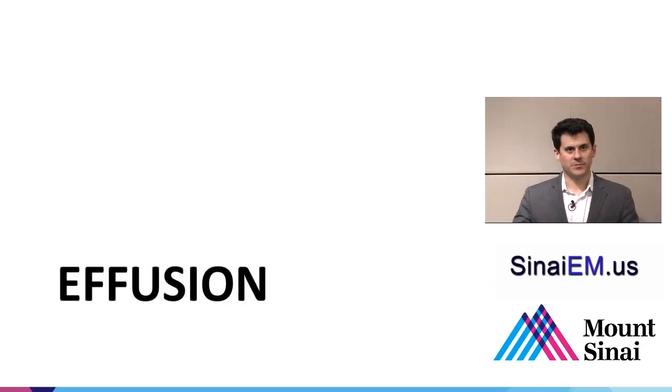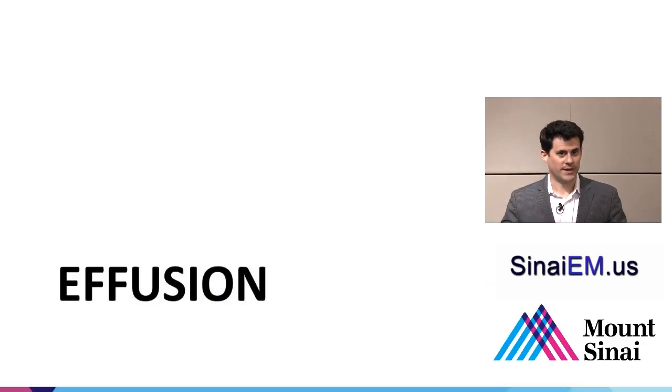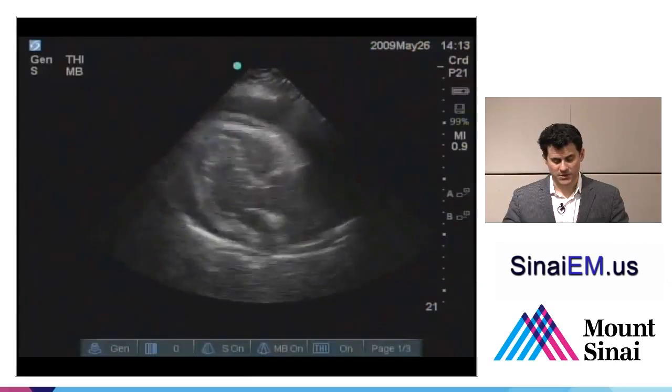So let's talk about some of the basic things that we can look for using cardiac ultrasound. Again, there's a world of cardiac sonography out there, but some of the basic applications can be very useful at the bedside. So let's look at effusion.